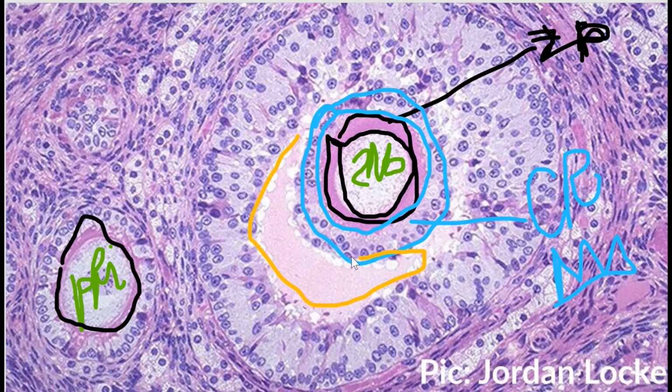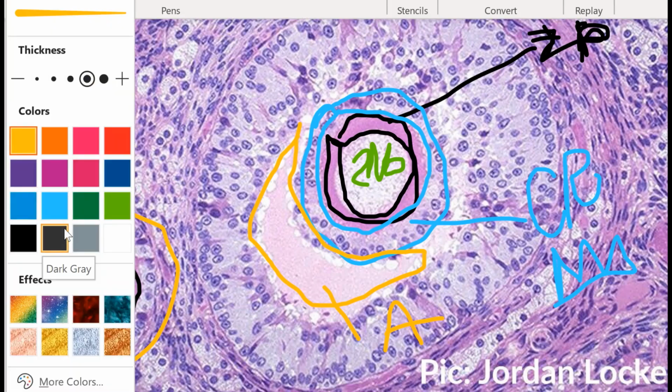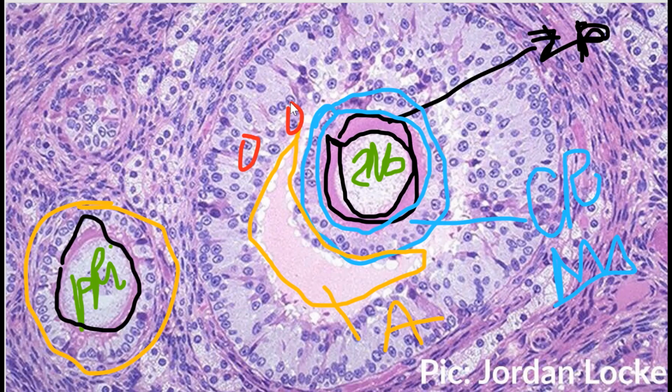So this here is our antrum. Remember, the primary guy over here doesn't have an antrum yet. But this one, he's a secondary one. And he's starting to get his. It's not as big as like the adult guy, Graafian, but it's still there. Okay. So then he has his granulosa cells, which are up in this region here. So all of these would be granulosa cells. Okay.